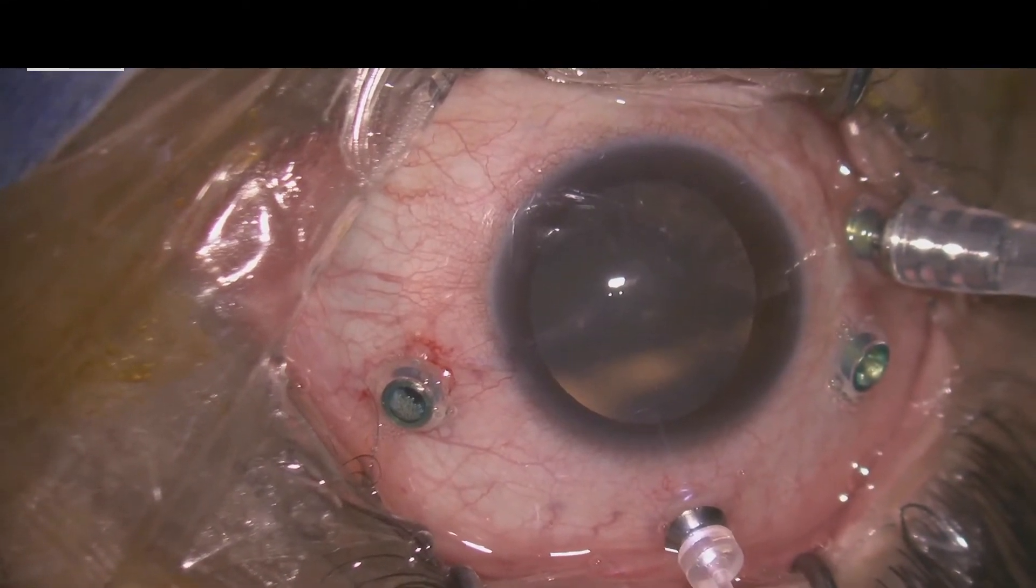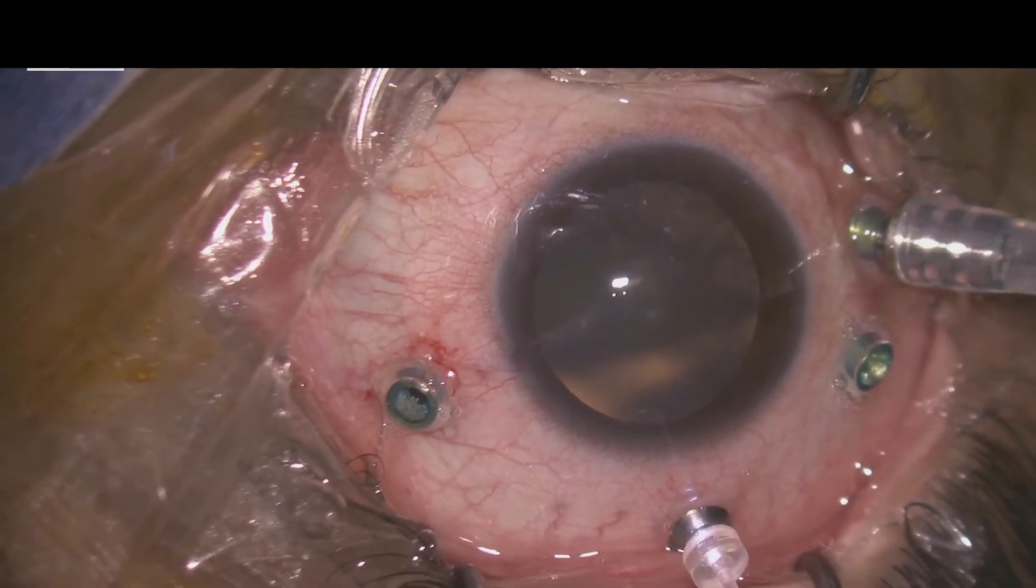Three-port 23-gauge vitrectomy was performed and a chandelier was placed. Anterior core vitrectomy was done. The vitreous surrounding the tumor was cut.